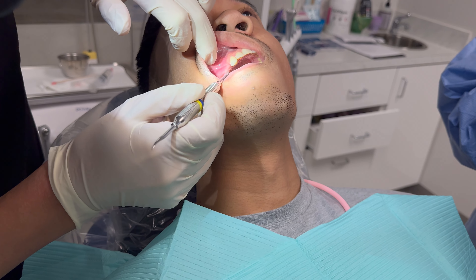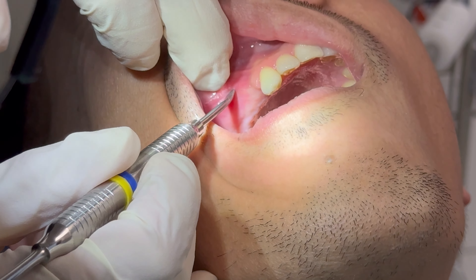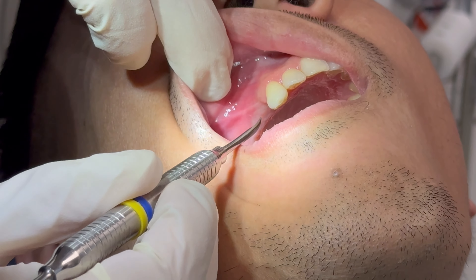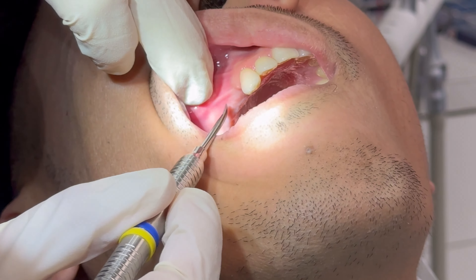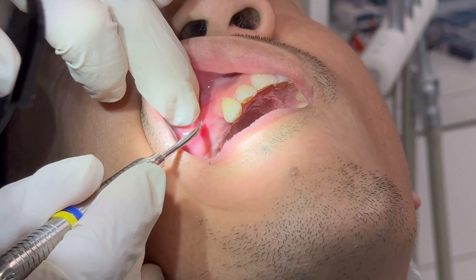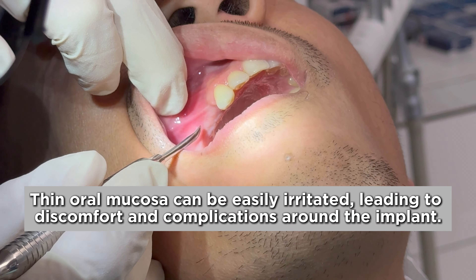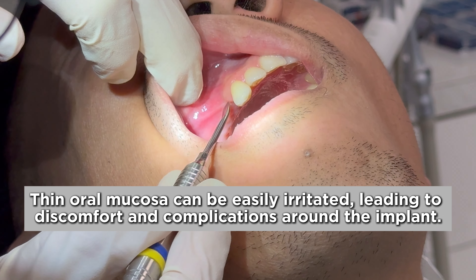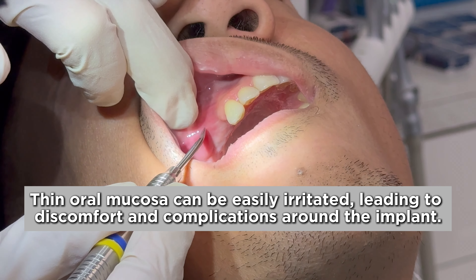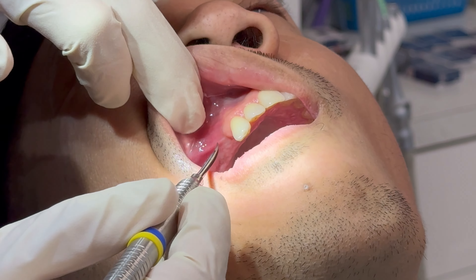Our other doctor did a sinus lift on him and placed two implants. These implants are buried in the bone so you can't see them, but the reason I wanted to show this video is that he actually has thinner gums and tissues — what we call a thinner biotype. You can see this movable tissue right here. I can use this blunt instrument, and I have to be gentle because this gum tissue is more sensitive. This movable gum — what we call oral mucosa — you never want that right next to the future crown of the implant, because this tissue is thinner, more irritated, and basically not a very firm type of tissue.